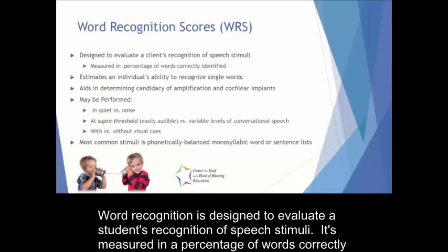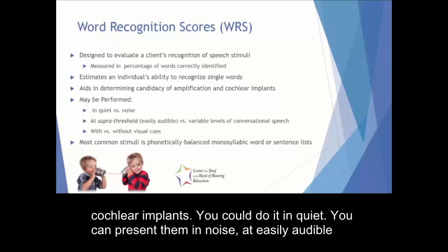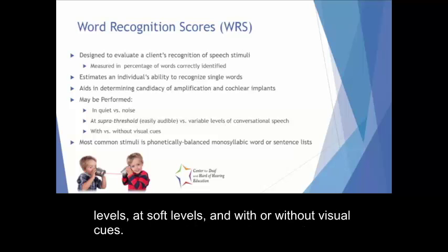Word recognition is designed to evaluate a student's recognition of speech stimuli. It's measured in a percentage of words correctly identified, and it can estimate their ability to recognize single words. It can also help determine amplification candidacy, as well as for cochlear implants. You can do it in quiet. You can present them in noise at easily audible levels or at soft levels and with or without visual cues.